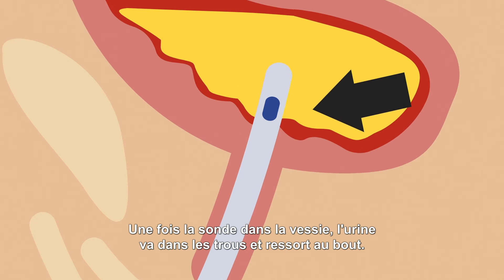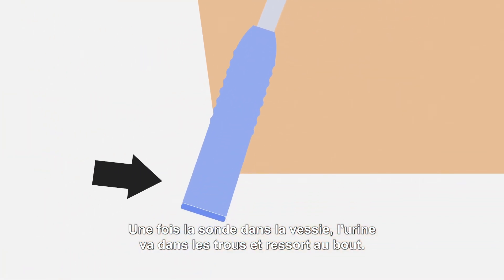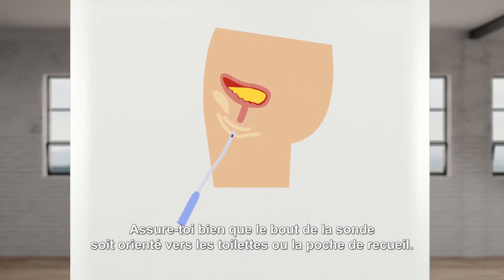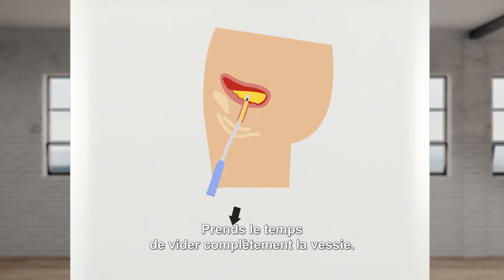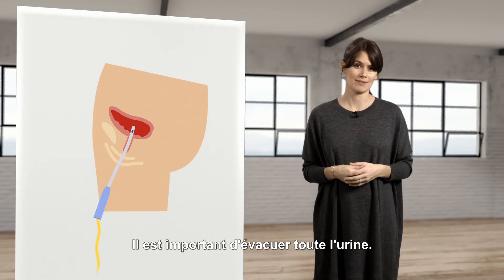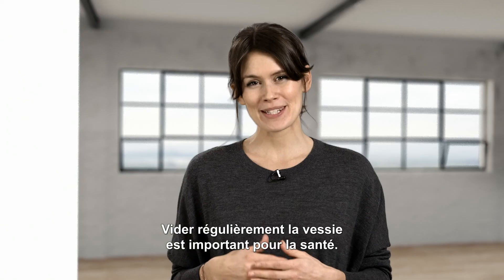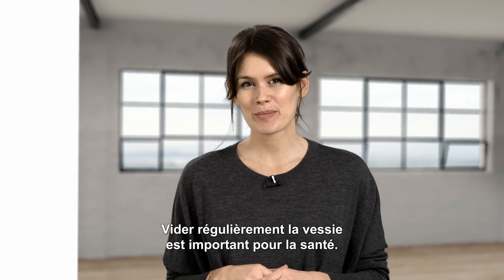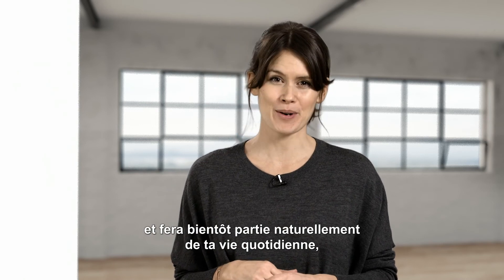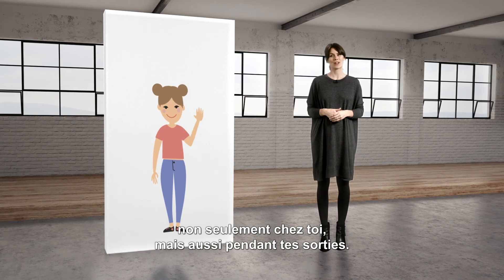Once the catheter gets inside the bladder, the pee goes in through the holes and out through the connector. Make sure the funnel end of the catheter is pointing down into the toilet or drainage bag. Take time to completely empty your bladder — it is important to make sure that all the pee comes out. You can then throw your catheter away. Emptying your bladder regularly is an important part of staying healthy. Self-catheterization will help you and will soon be a natural part of your everyday life, not only in your home, but also when you are out and about.